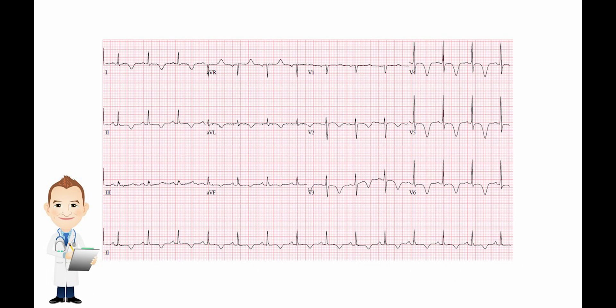This is the next EKG in our series. What we want to look at first is the rate, rhythm, and axis. You're looking at a pretty normal rate, just eyeballing it. I'm not going to count every single one of these. The axis is fine — leads one and two are both upright. There's a P before every QRS. There's nothing irregular about this. However, you want to look over here at the side.